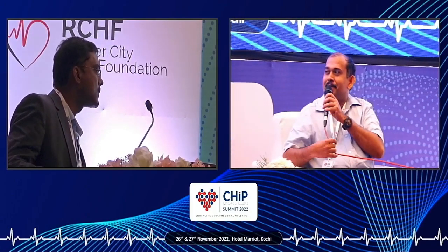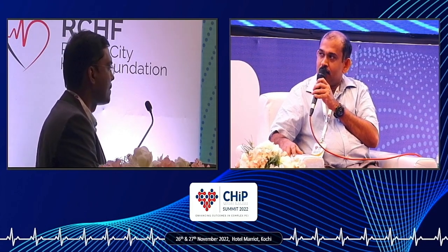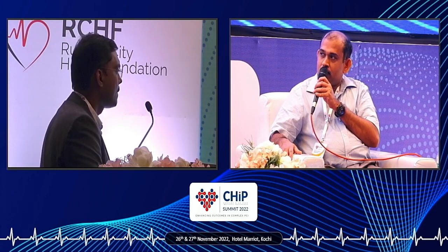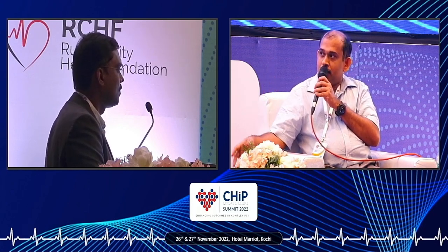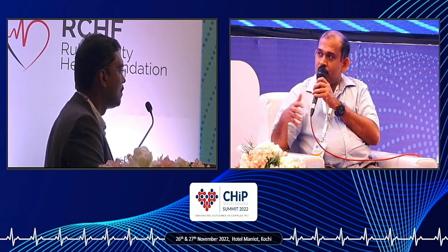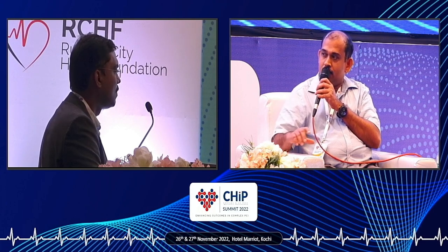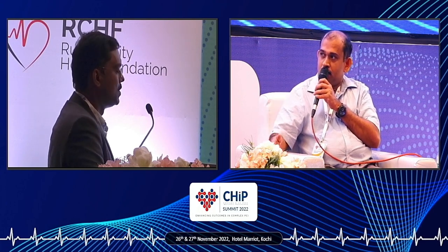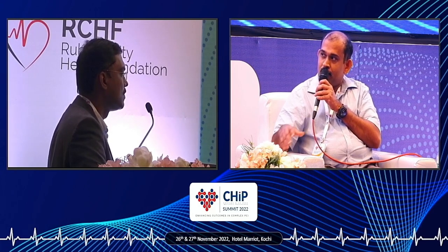Thank you, sir, for the laser-guided PTCA. I just want to know, if you have in-stent restenosis, among the different debulking tools, from cutting balloon or scoring balloon to lithotripsy to the latest laser now, how do you choose, or if it's available freely, how will you specify which is to be preferred, like focal restenosis, diffuse restenosis, thrombus or without thrombus, or diffuse intimal hyperplasia? Can you specify any of the ways?